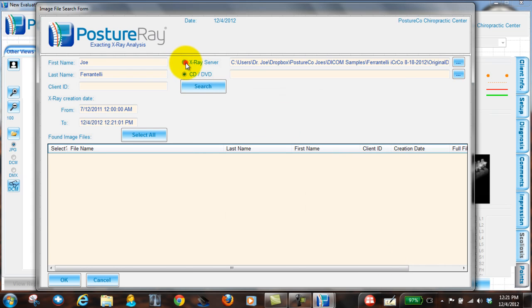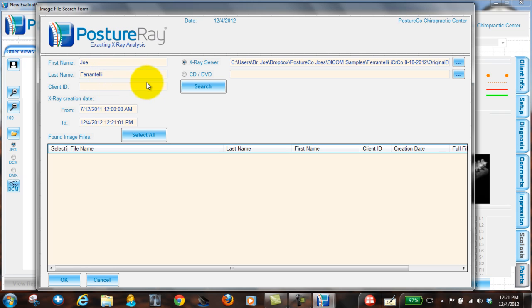But if I had a CD from say a hospital or radiology center, all I would do is click here and basically just browse to the computer and browse to that CD drive. I'm going to use the X-ray server. Now we pull in images from an image store or from images exported as .dcms or .dic, DICOM image files. So if all that information is correct, we would hit search.